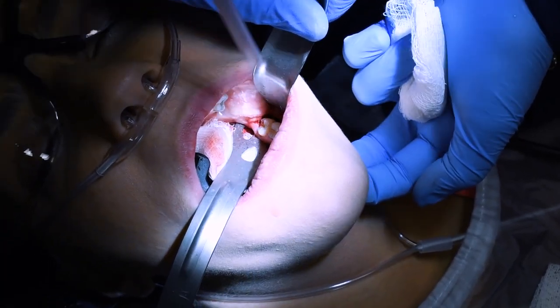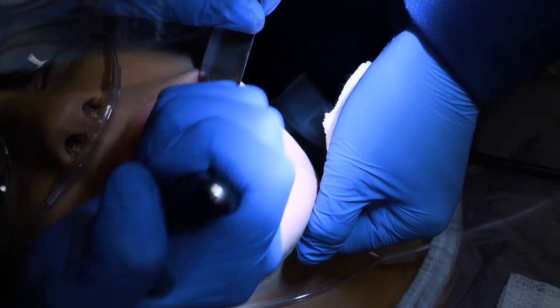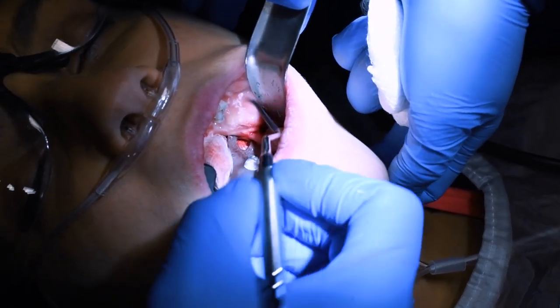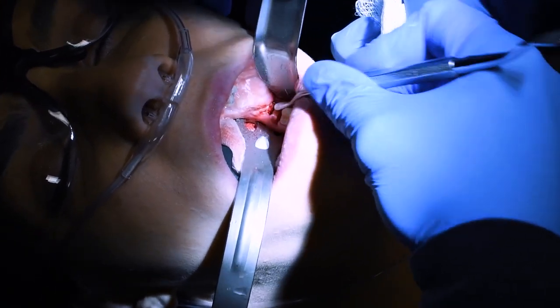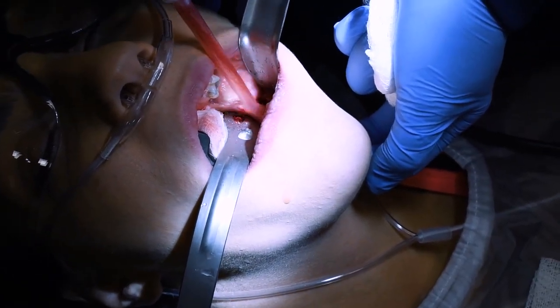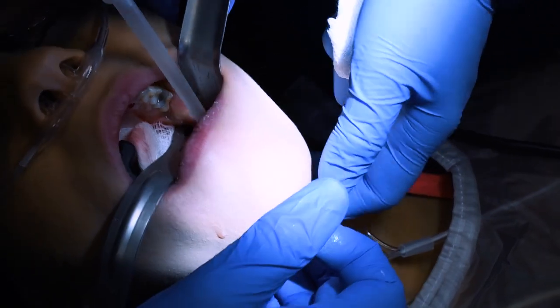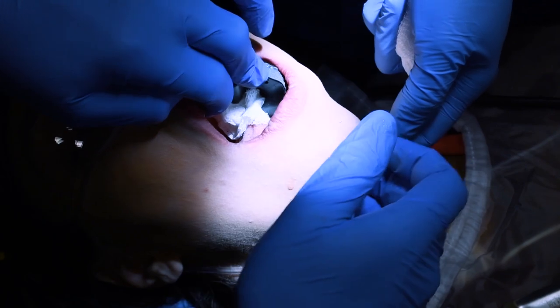I'm going to place this so you guys can see. Give it a little gently roll around. There's that little hook at the end - not too bad, I'll take it. So that's that tooth gone. Now I'm going to make sure there's no granulation tissue, that everything's clean, no follicles. Make sure it's smooth with a bone file - give it irrigation and then it's good. So out of the three teeth and two implants - let's call that five things - we're done one. I'll need another periapical screen right in this area. We're going to do the exact same thing on the other side.